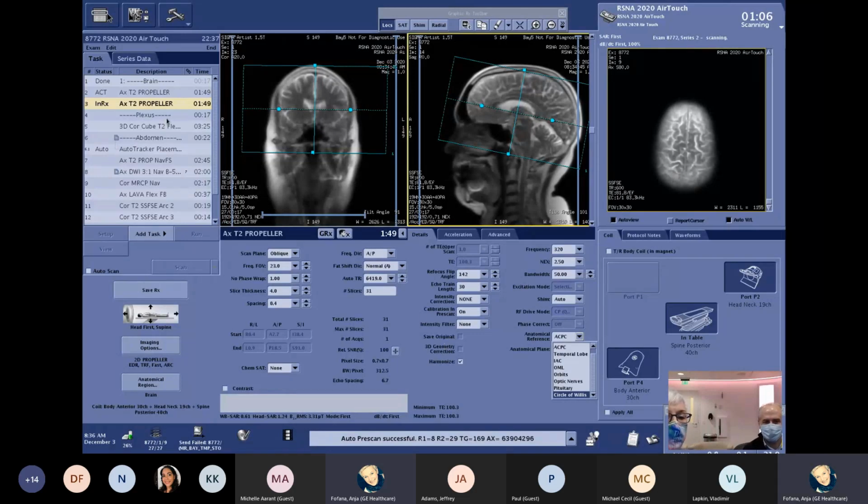So we tried in-house to beat the deep learning machine and try to be better, because we think with our 15-year plus experience, we are better in slice prescription than a machine. Unfortunately, we have to admit we always lost that game.